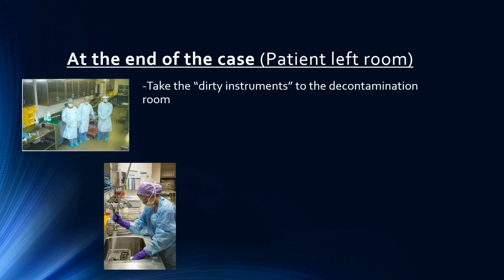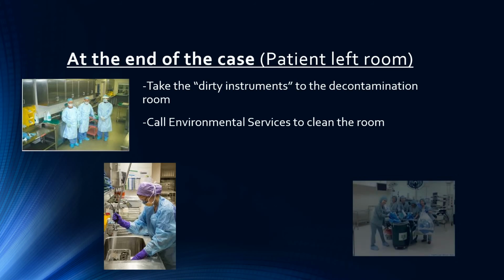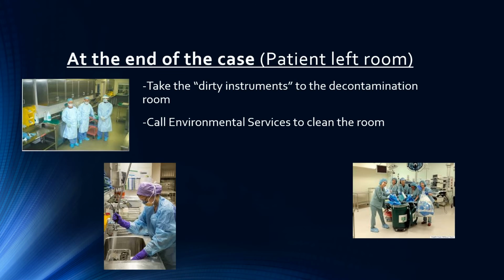At the end of the case, and the patient has already left the room, you want to take the dirty instruments to the decontam room. You want to call environmental services to clean the room. And so again, you take the instruments, particularly the eye instrumentation, over to the decontam room, and spray them if it's your last case of the day and there's nobody around. If there's somebody there, obviously you don't have to spray them.